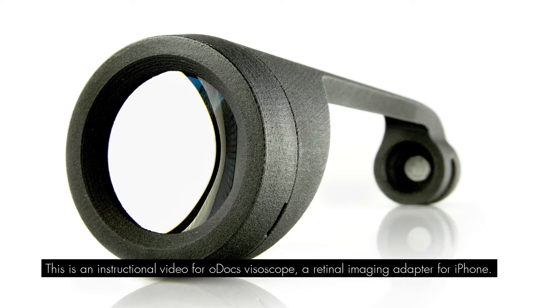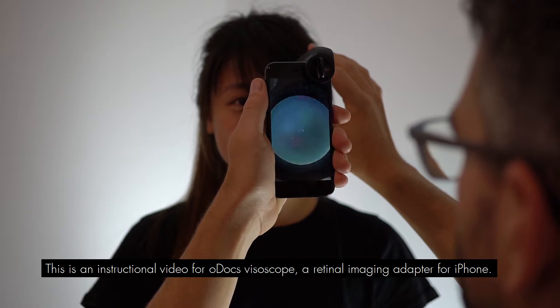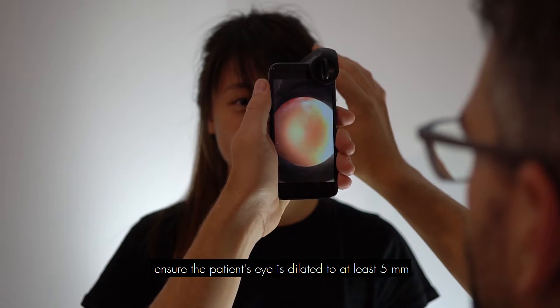This is an instructional video for the oDocs visoScope, a retinal imaging adapter for iPhone. Ensure the patient's eye is dilated to at least five millimeters.